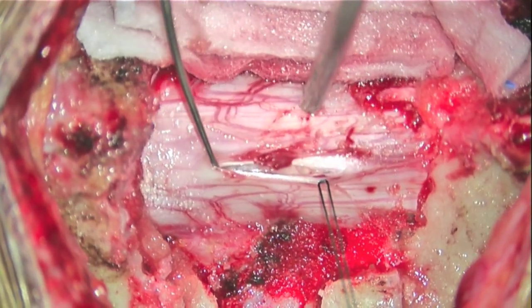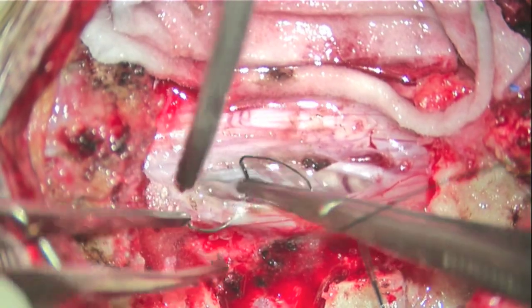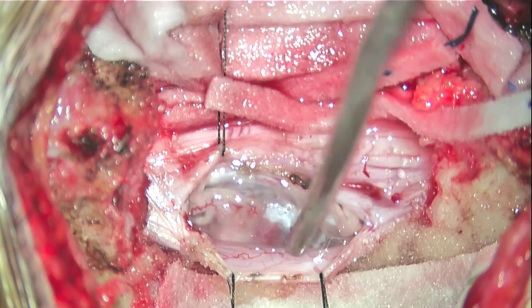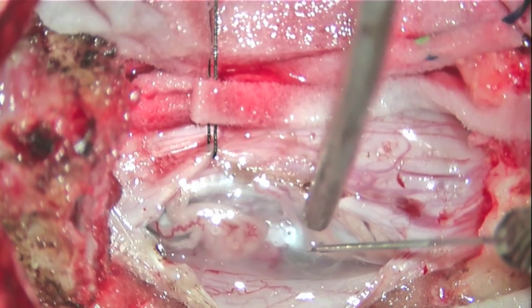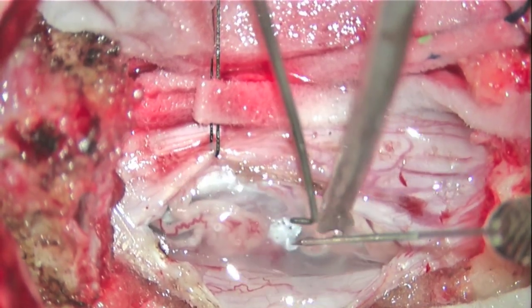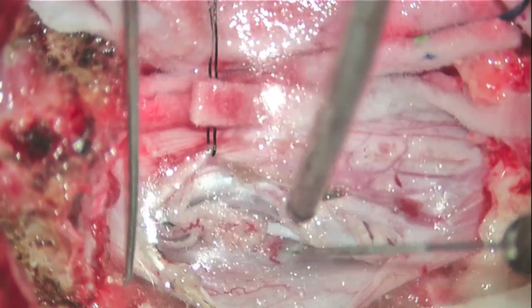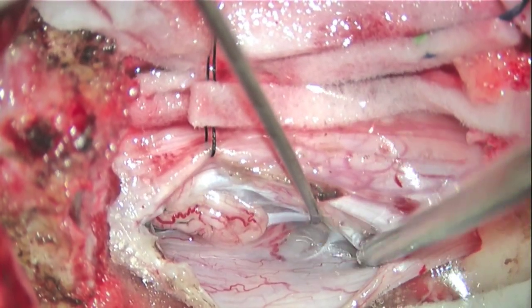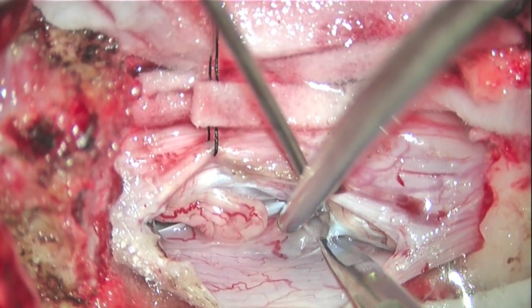Note that the arachnoid has been left intact and will be opened separately. The dura is tented laterally to the muscle with 4-0 silk sutures. The arachnoid is then opened separately to reduce epidural bleeding. The tumor is located ventral in the canal, so 2 dentate ligament attachments are cut to improve access to the tumor.